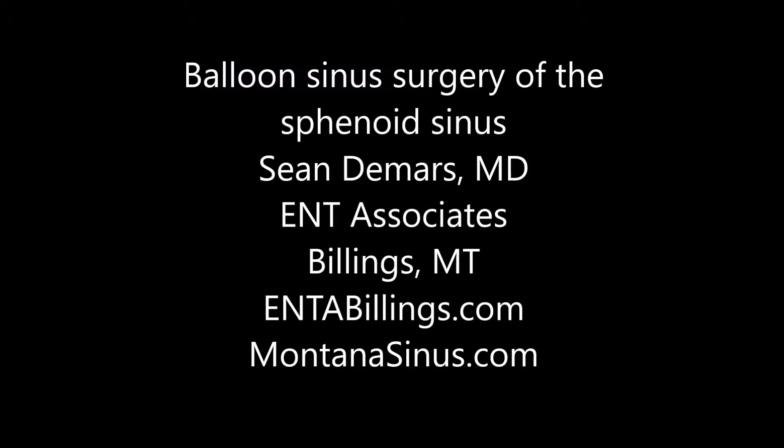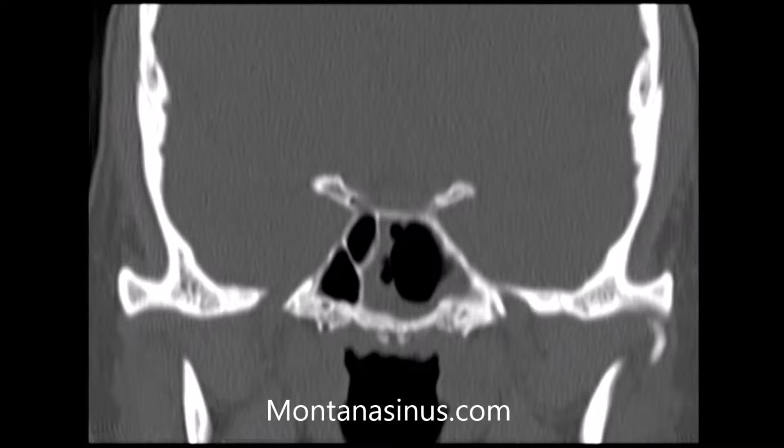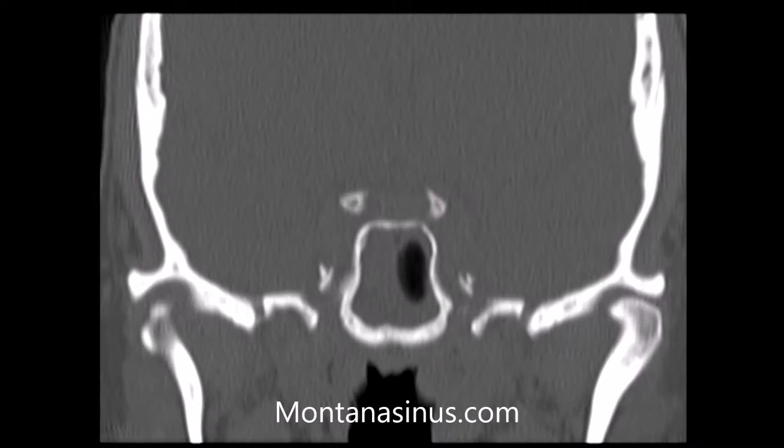This is an example of balloon sinus surgery used to treat both acute and chronic sinus problems. The normal-appearing sinus is on the left of the screen, with the thin white bone of the sinus filled with black air. On the right side of the screen, the gray rim inside of the bone represents mucus and swollen tissue.